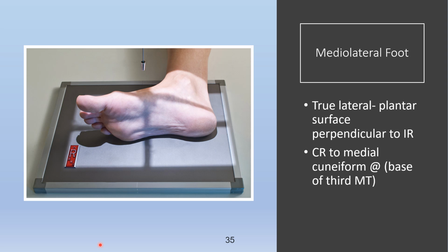All right, and then our last image is a medial-lateral projection of the foot. So this is a lateral on page 234. Your technique doesn't change. Your IR does need to move so that the long axis of the part goes with the long axis of the IR. So it is possible that you turn your image receptor to the patient in this lateral position. You're still at a 40-inch SID.